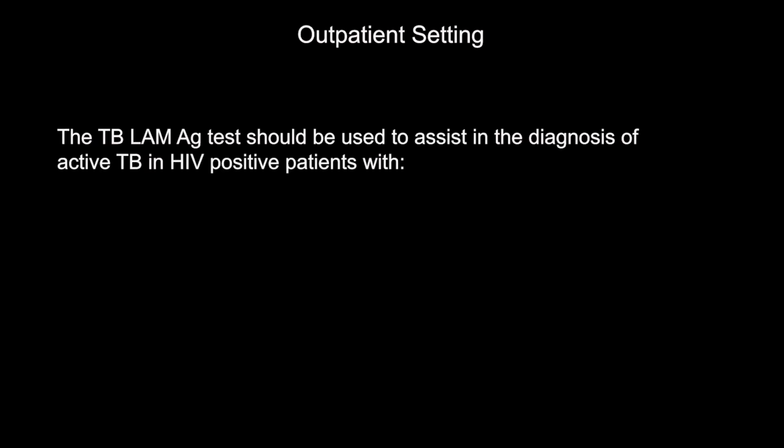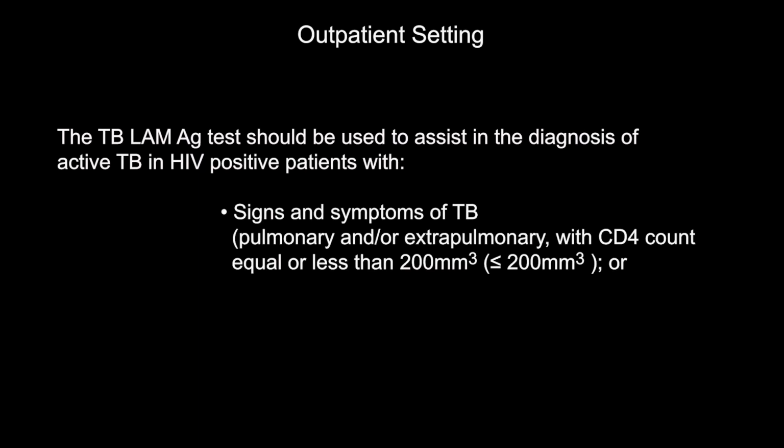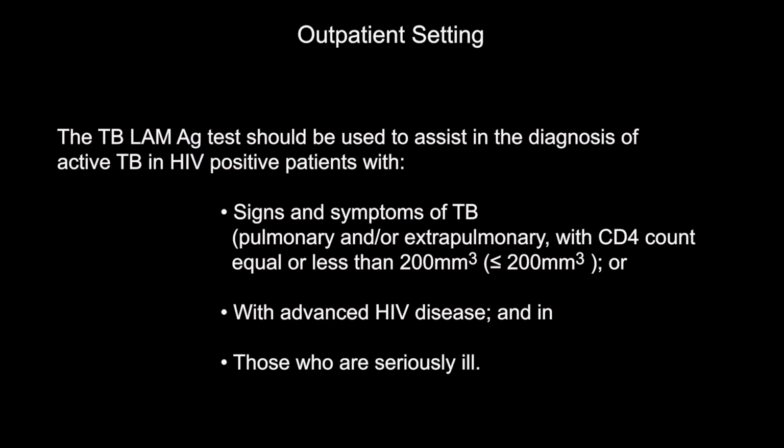For outpatient use, the urine TB LAM test can be used in patients with signs and symptoms of pulmonary TB or extrapulmonary TB with a CD4 count of 200 or less, in patients with advanced HIV disease, and in patients who are seriously ill.